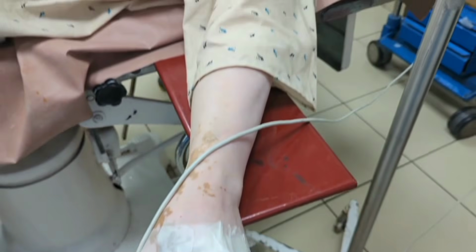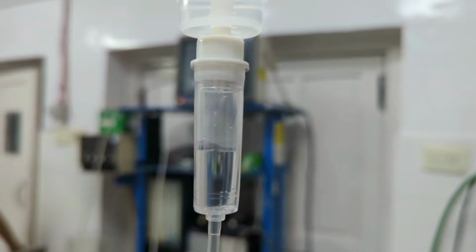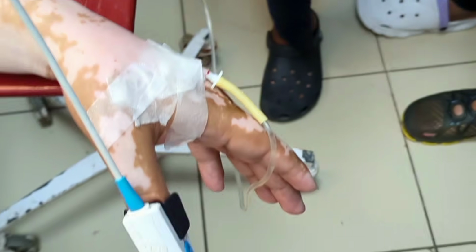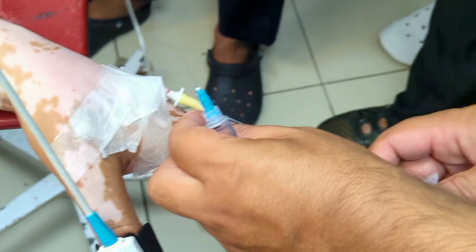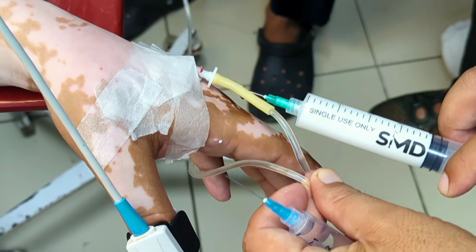First of all, the patient was received in the operation theater and positioned comfortably on the operating table. Standard monitoring devices were attached, including ECG electrodes to monitor the heart, a pulse oximeter to measure oxygen saturation, and a blood pressure cuff to monitor blood pressure throughout the procedure. Through this IV line, the induction agents were administered.